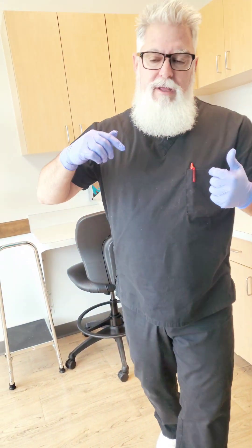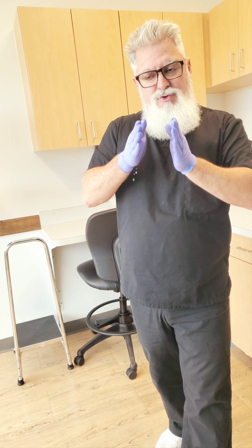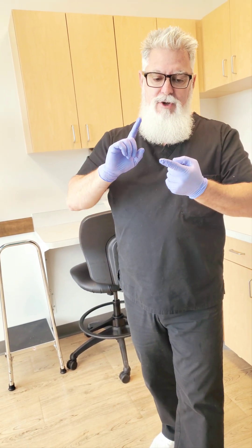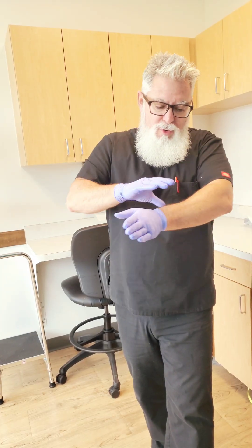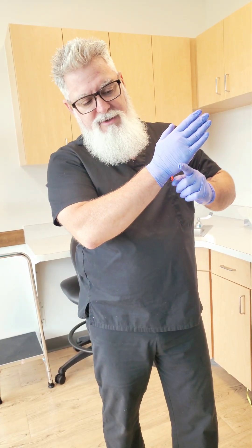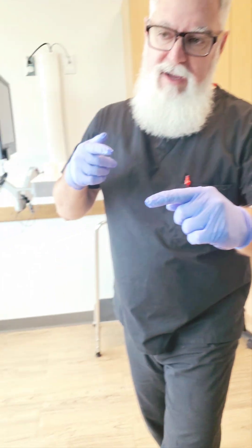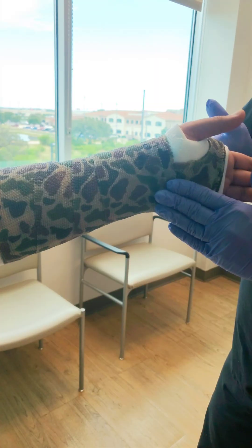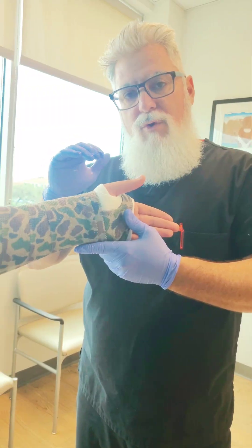Hey guys, welcome back. Woody here. We are in the middle of making a series of short training videos on how to do a cast with a mold. So far, the first video was a short arm cast with an interosseous mold, the second video was a short arm cast with an ulnar deviation — which you can see here, starting to set up really nicely.